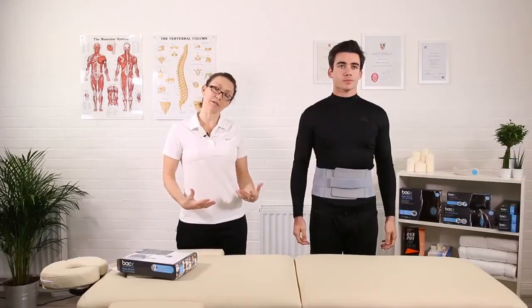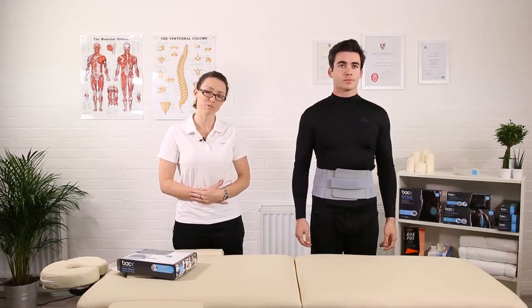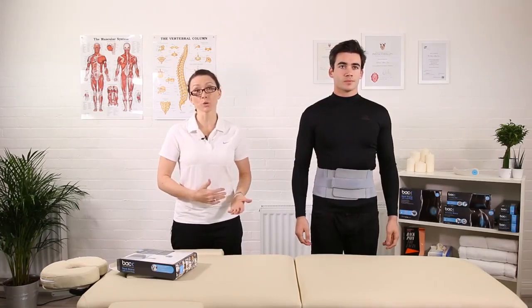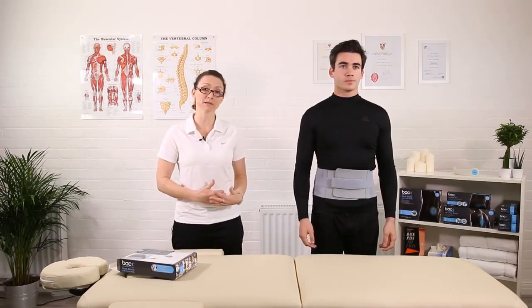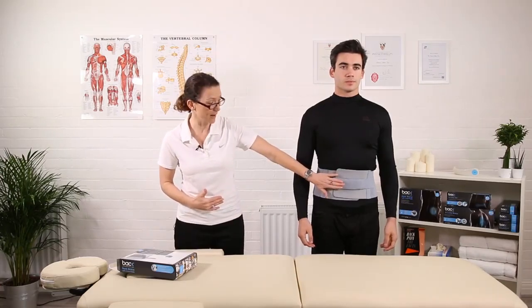Take the two small straps and fasten them in place. When you first put it on, it's a good idea to take a nice deep breath so that when you've got it on it's not too tight. It's important that it doesn't impair your breathing at all and it feels comfortable to wear. Don't forget you can always put more tension through the belt should you feel you need it.